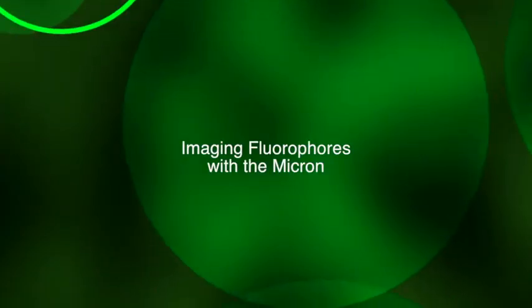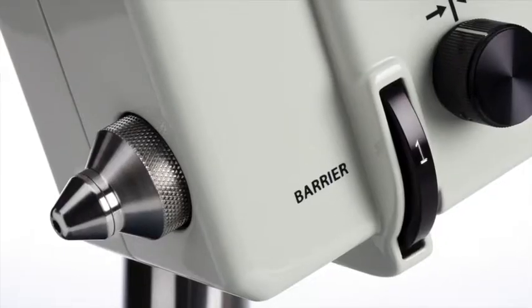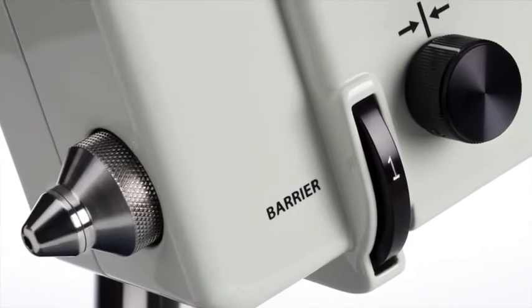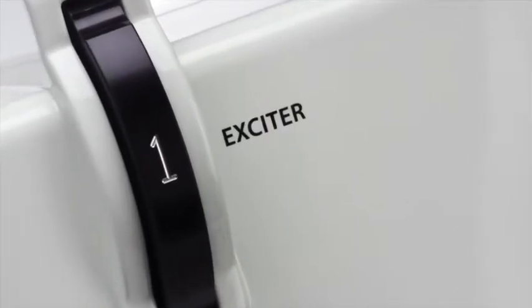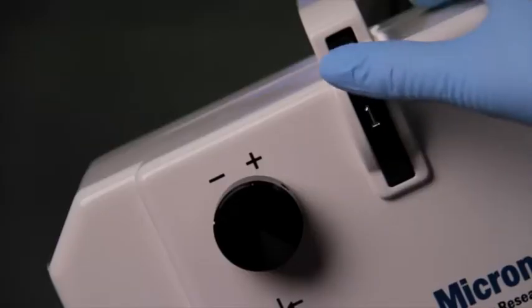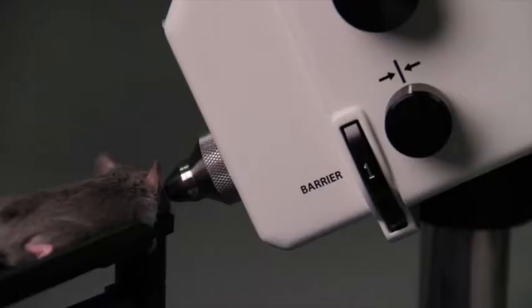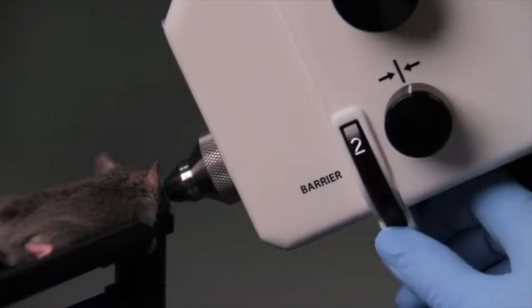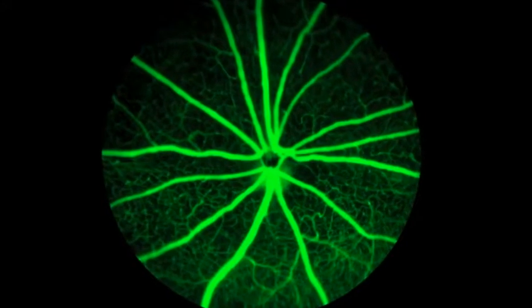Imaging fluorophores with the Micron is as simple as the turn of a couple of dials. A barrier filter wheel and an exciter filter wheel hold positions for four filters. By turning each filter wheel from the bright field at position 1 to position 2, you can easily switch to fluorescein imaging.